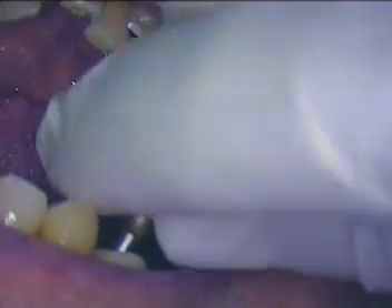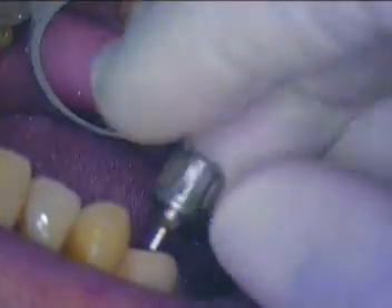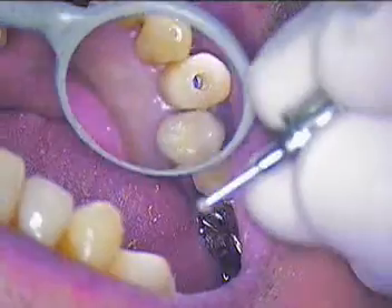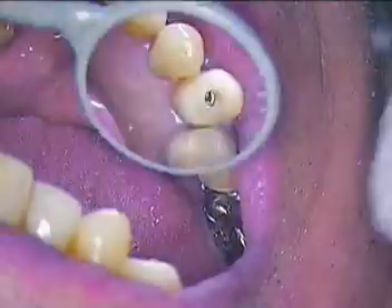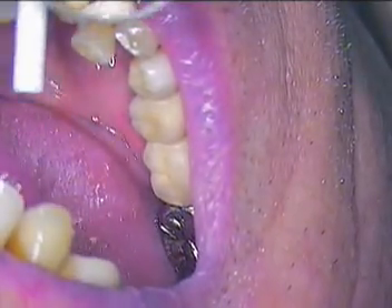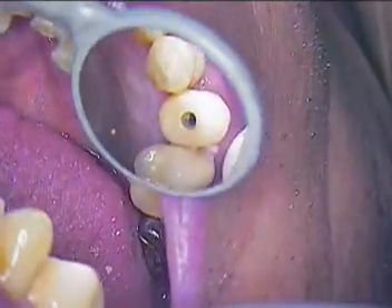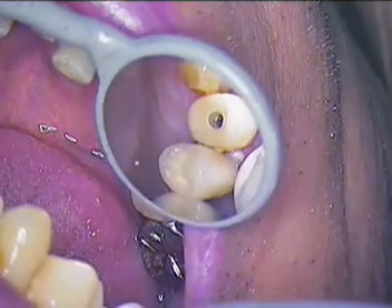We'll back that out. I'm not going to take it out quite yet because there are other things I have to do first before we get our impression, so I'm just loosening it up. I want to be real careful not to have debris in the area, so we're going to tighten that down again, rinse everything off all around, and clean up everything around this temporary. I'm going to pause here and come back with the temporary off and everything cleaned up, ready to put in our transfer coping for the impression.